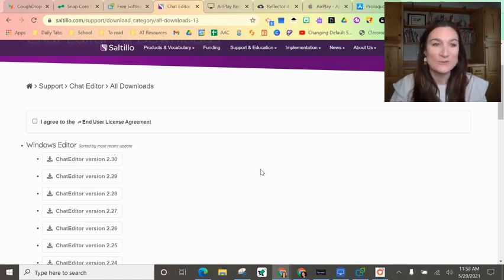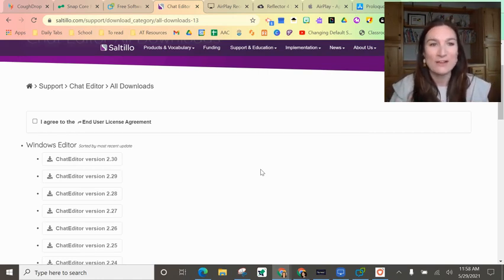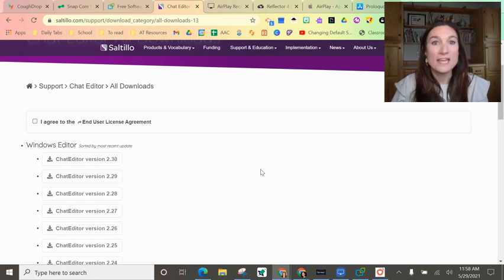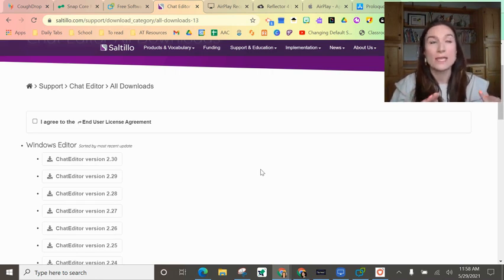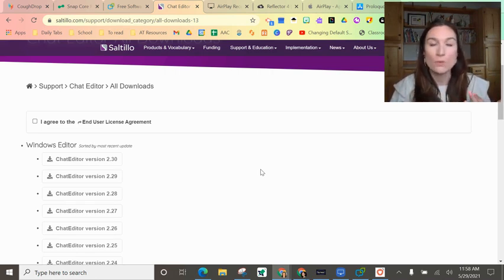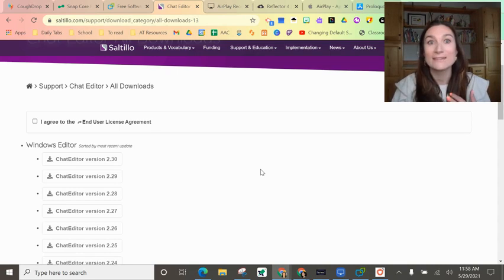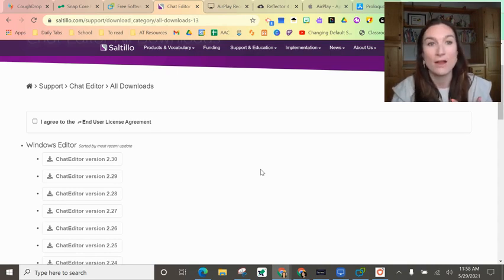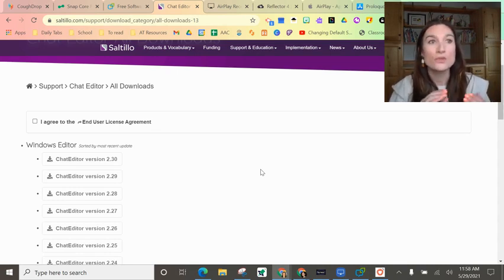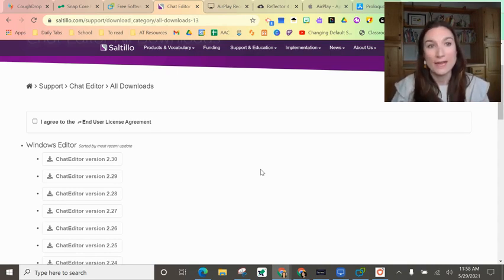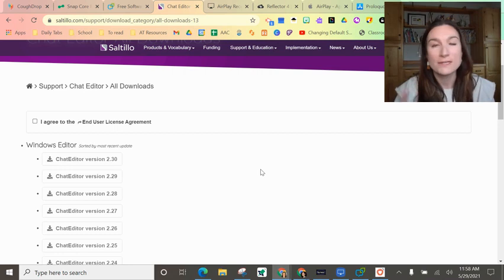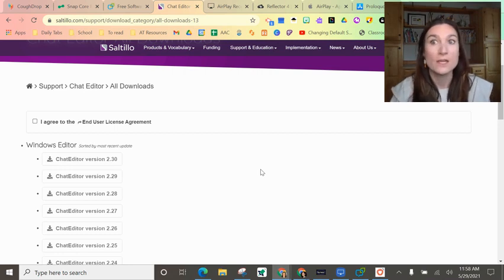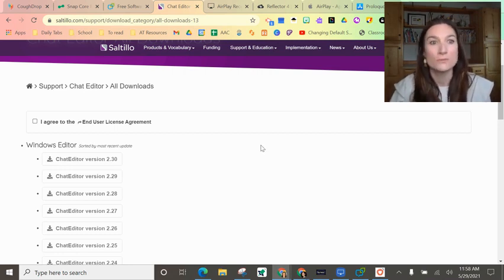Ask your Saltillo rep or somebody else. I don't know exactly how to do that, but I know it's possible to get voice output. Chat Editor also can support TouchChat, WordPower, and LAMP. You can get those on there and you can do something similar to the write with icons feature. Christine Bodden has a video on how to do that on her YouTube channel.